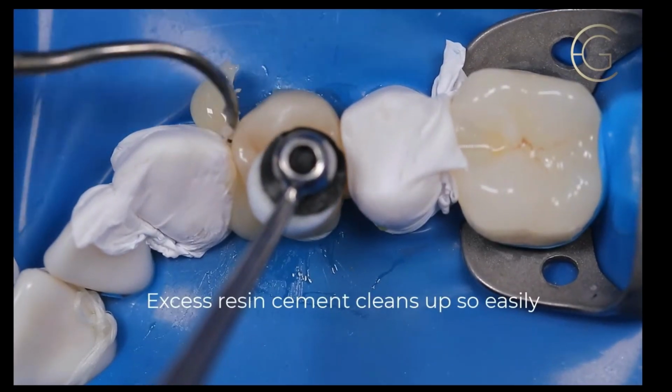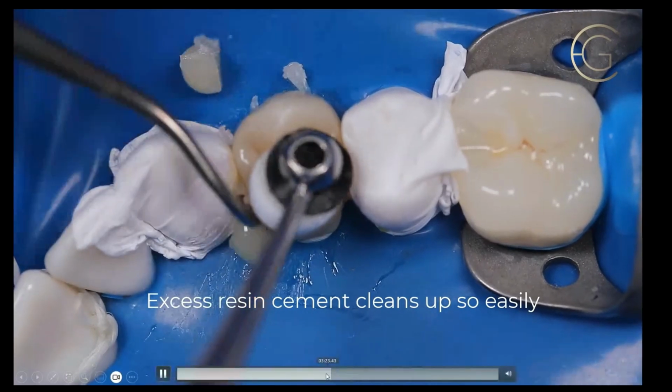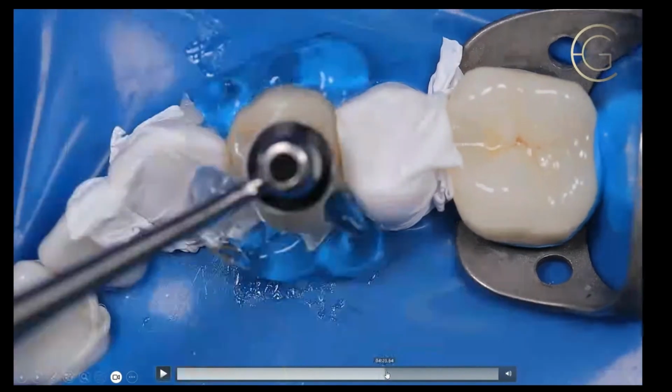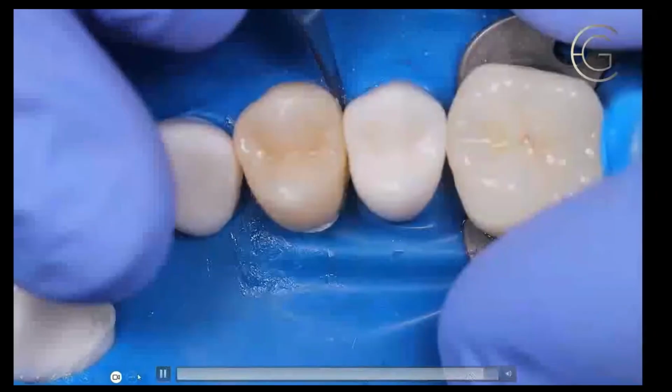I could use a gold knife, repurposed from when I was doing gold foils, but it cleans up so easy. Okay, so I don't think you need to watch me cleaning this up. I'm going to use my floss and remove everything, and we have a final product.